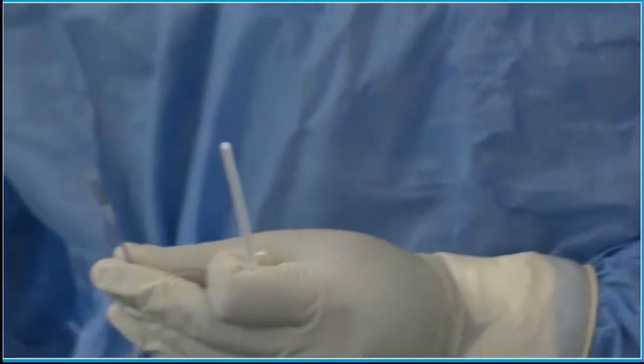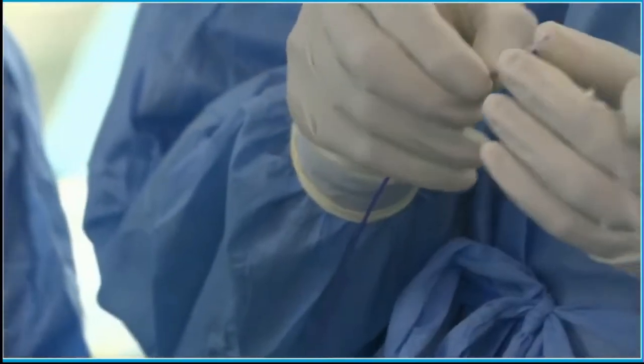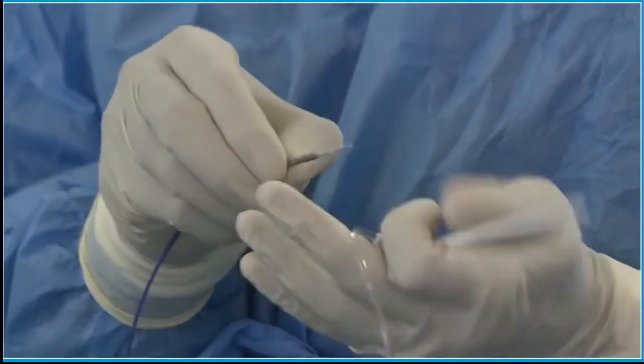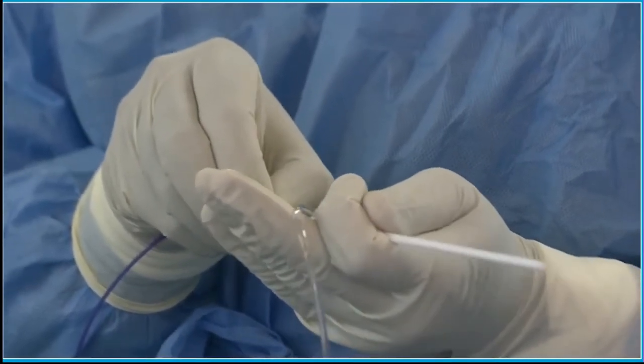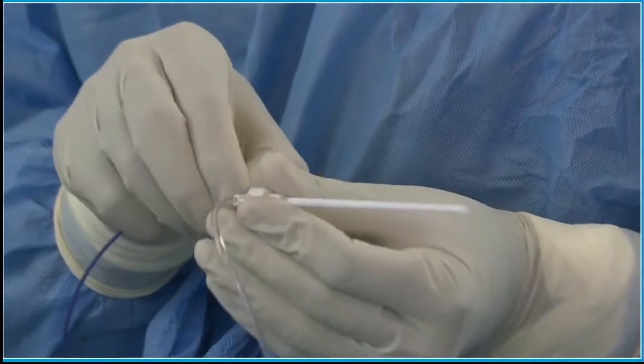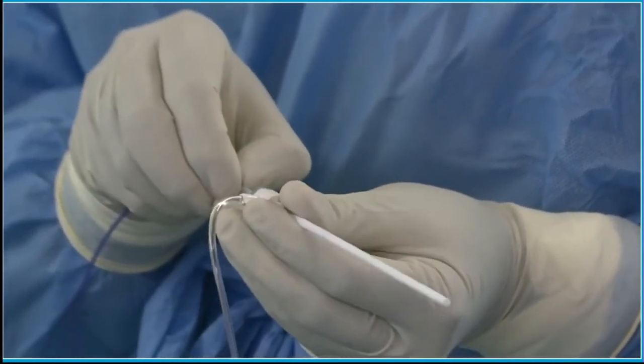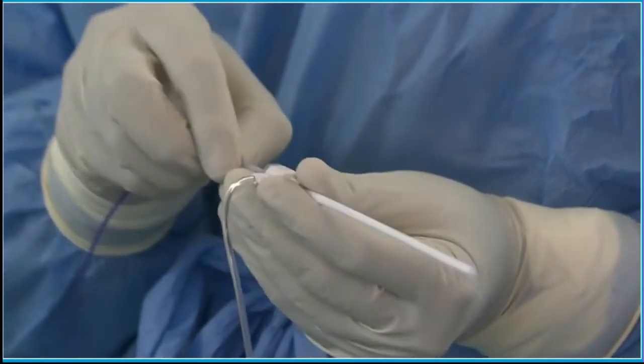Slightly inflate. No, Shiva, I take Chetan's point. I think you may commit yourself to stent. I have no objection. But I think that there is no justification in not looking at the hemodynamics and angiographic picture after you have ballooned it. I think if you get a great result, I agree.